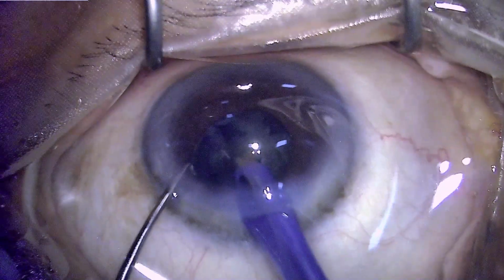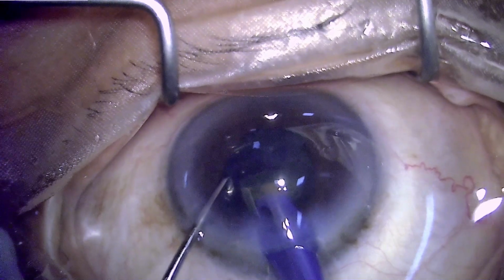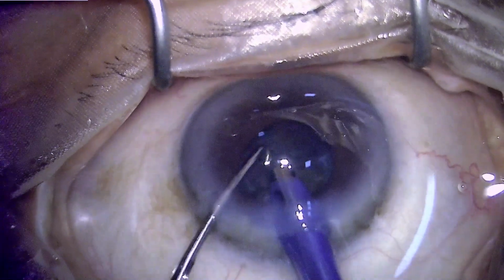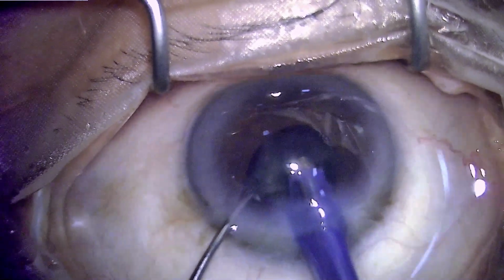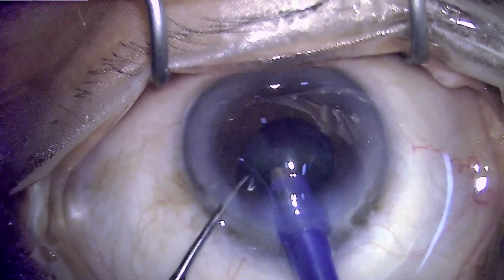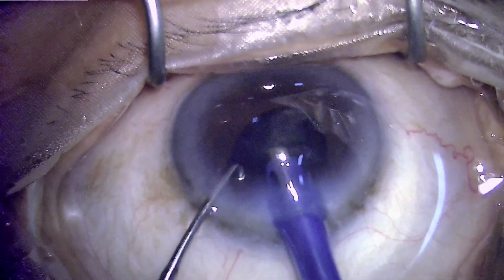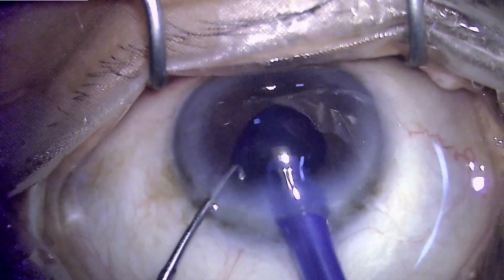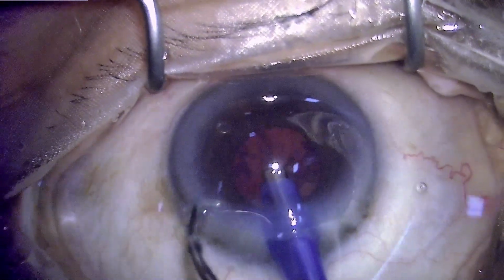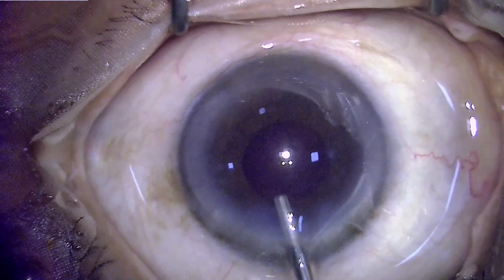In a small pupil, it's very important to safeguard the iris tissue, because if the iris comes in contact with the phaco tip, it can get damaged. This can be detrimental in these patients because the pupil plays a very important role in optimum vision. We all know that pupil size has a role to play, especially in improving the depth of focus when it gets smaller, as in attempted near vision. So the miosis helps in aiding the focus for near.